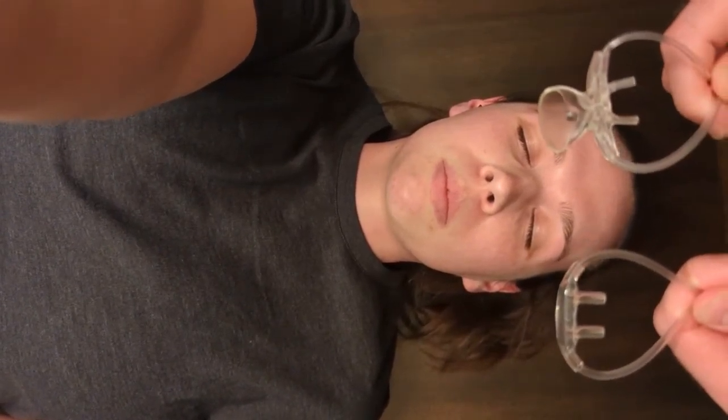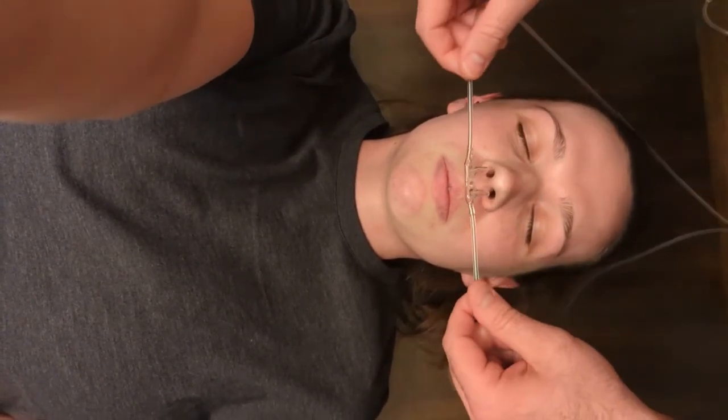For RSI, we'll need to place two different nasal cannulas, the non-end-tidal cannula and the end-tidal cannula. The best way to do this is to first place the non-end-tidal cannula. Same way: prongs in, around the ears, traction, securing ring. Then place the end-tidal cannula: prongs in, around the ears, traction, securing ring.